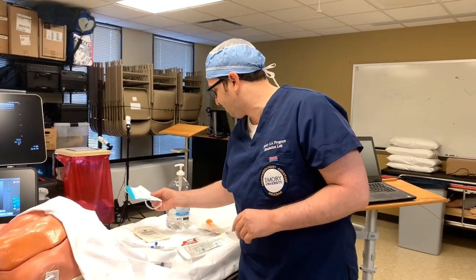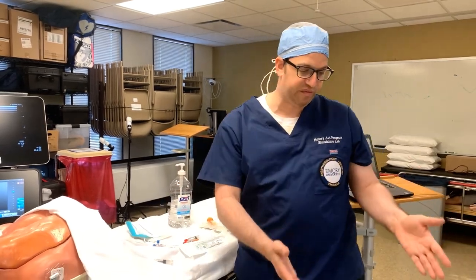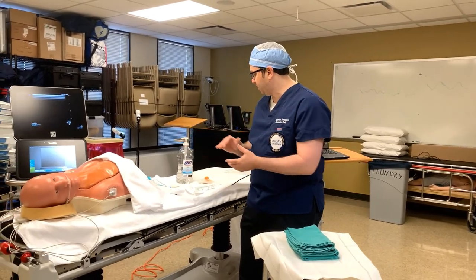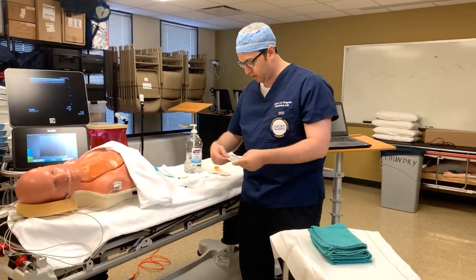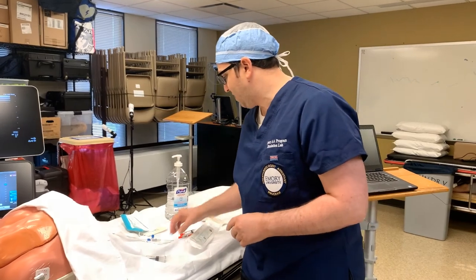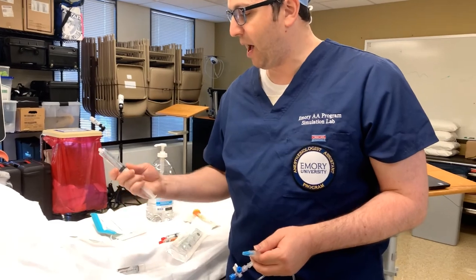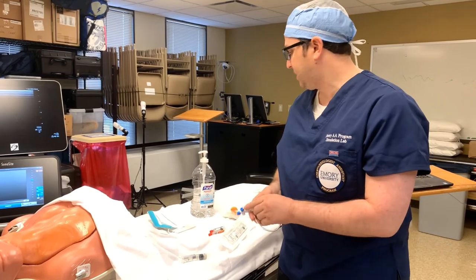We have PPE — a face mask and sterile gloves. I have a sterile field that I've already opened with some sterile towels, and I'm going to be dropping the sterile equipment needed for the procedure onto my sterile field once we're about to get started. I have my echogenic needle for placement of the block, and then I have my tubing that's going to be connected to the needle with my local anesthetic and flush — that'll be connected at the three-way stopcock.